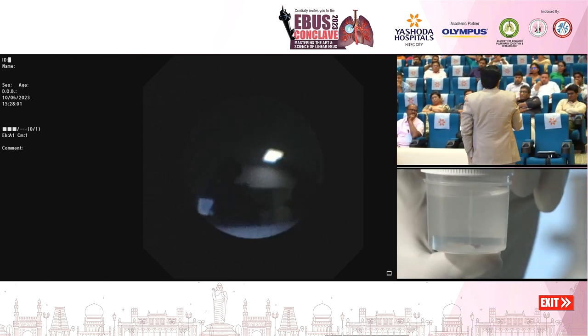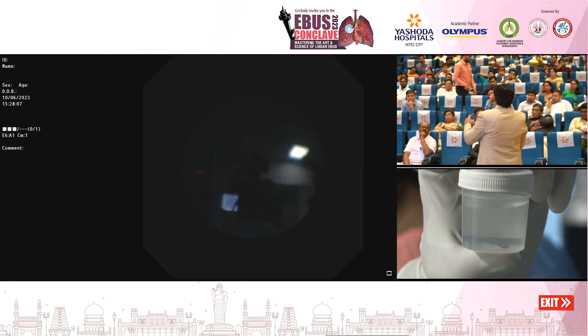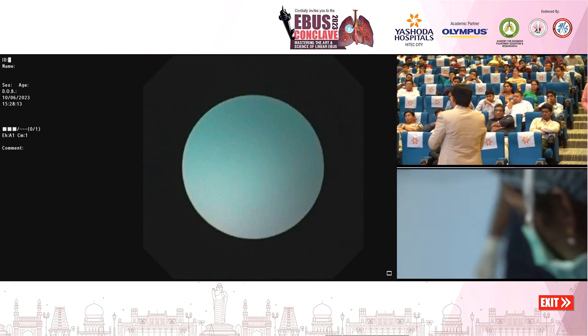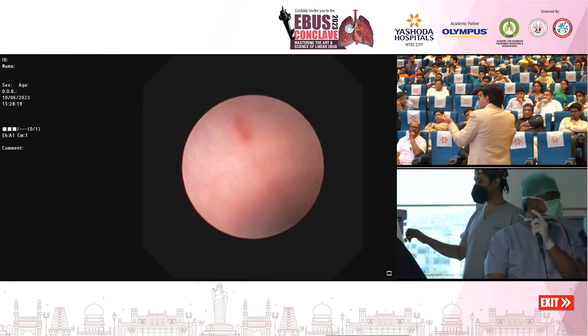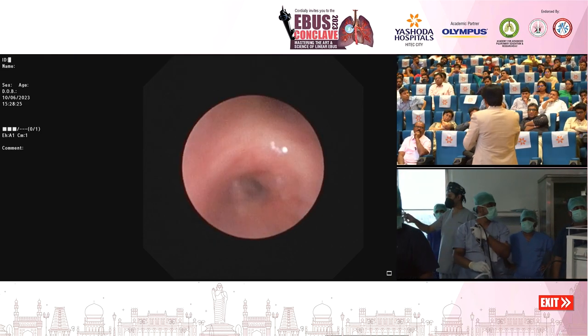For passing any extra accessory, whether a cryoprobe or a forceps, you have to have a tract. Only for the needle biopsies, that is the beauty. You have three biopsy needles. One is the 19G needle itself, which is a biopsy needle. The Boston Acquire needle is a biopsy needle, and the Cook's Procore needle is a biopsy needle. For these biopsy needles, the needle itself is the tract.